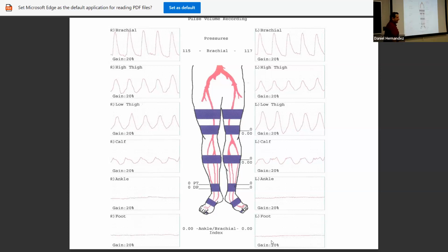When you get into the hospital, you start seeing it. So you give it a good attempt, and if I still can't find it with this exam, I might grab the ultrasound machine, ultrasound over the vessel to show that it is occluded, and add some ultrasound pictures to that study as well. Oh, you can do that. Yeah.